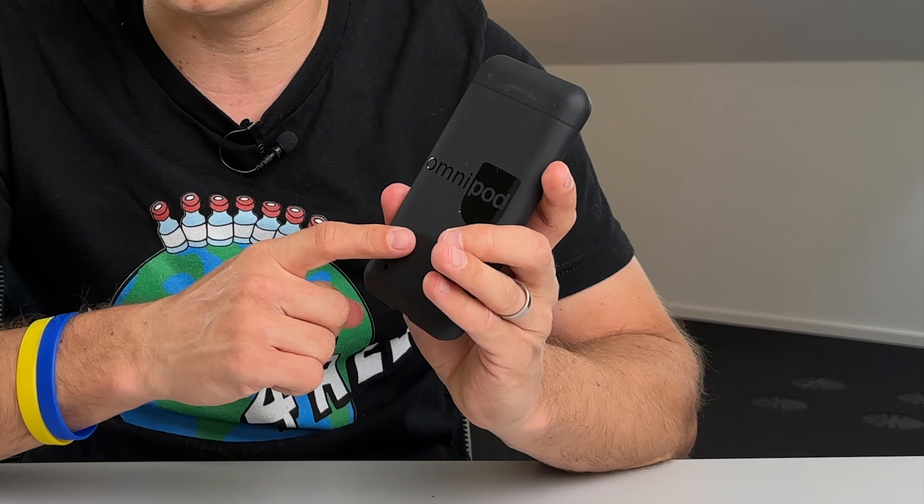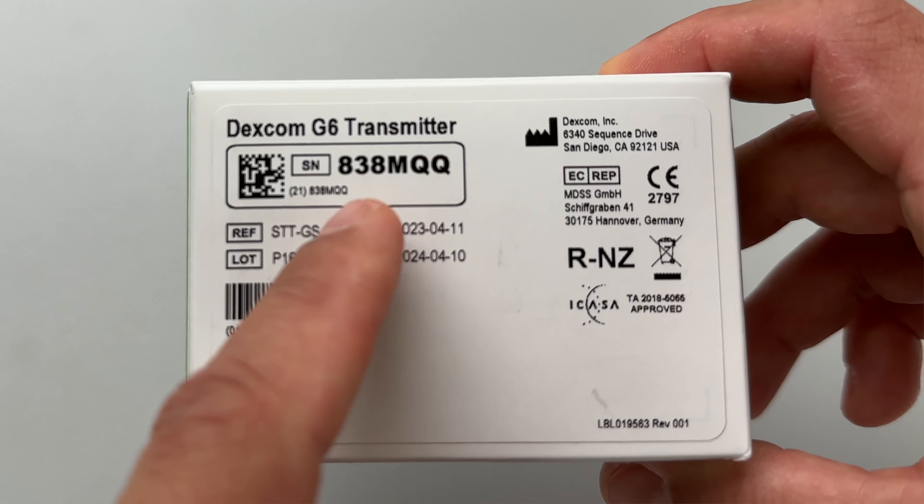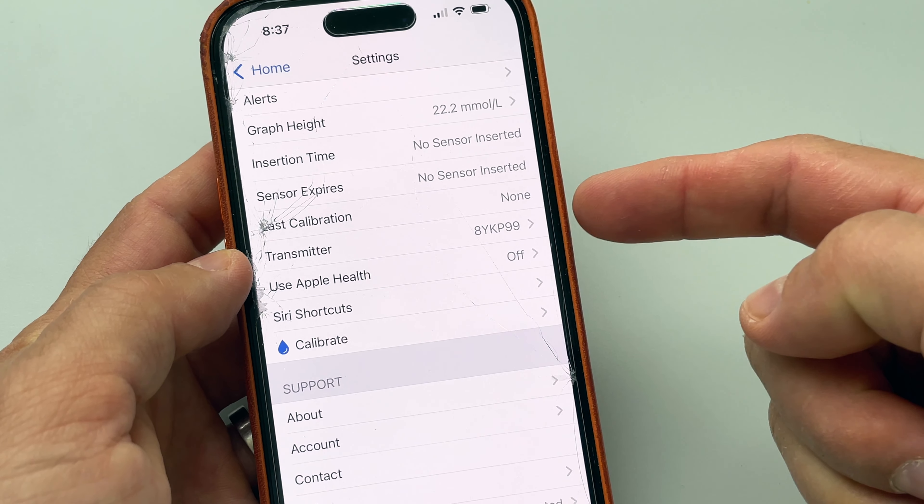Now we need to confirm that the cannula is inserted properly and that the pink color on the top of the pod is visible. Next, the system will ask if we want to connect our CGM — of course we want to do that! We need to put in the Dexcom G6 transmitter number. I didn't have my G6 on me when I started the Omnipod 5 setup, so I simply took the transmitter number from the back of the transmitter.